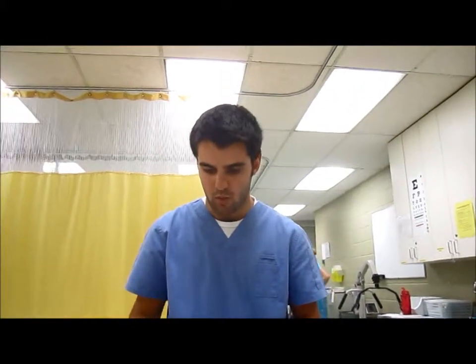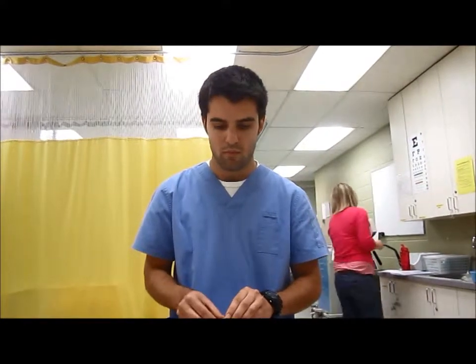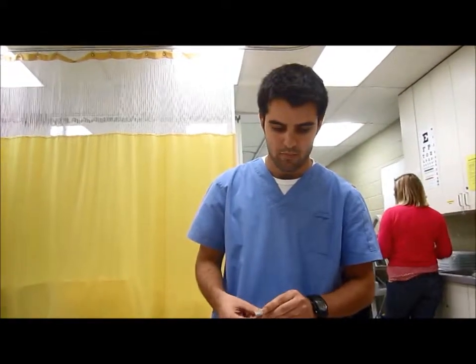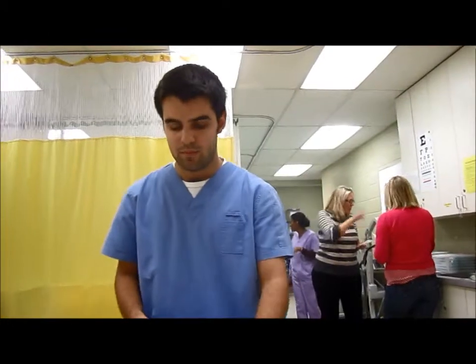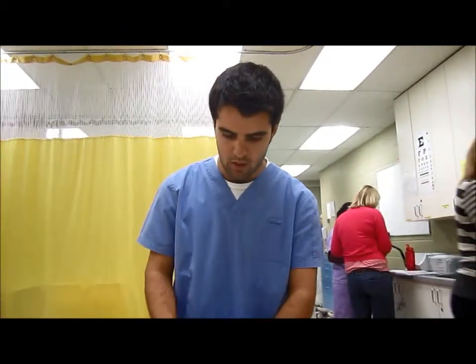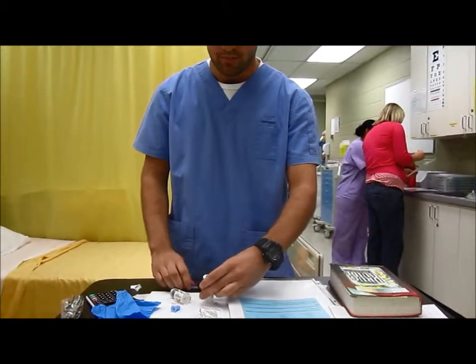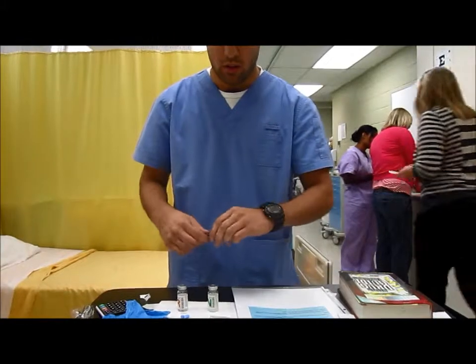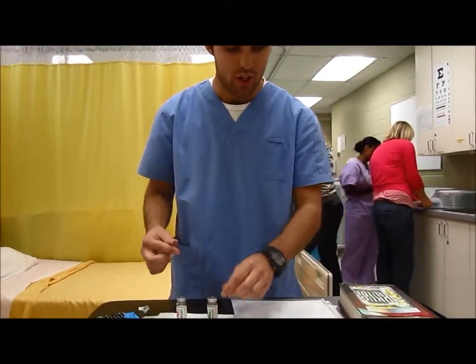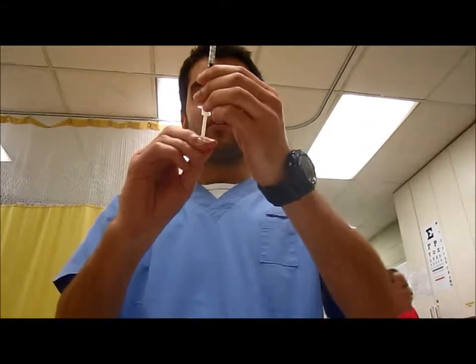Okay, so before I inject the medication, I would swab the top of both. And I would inject 16 units of air into the first needle.